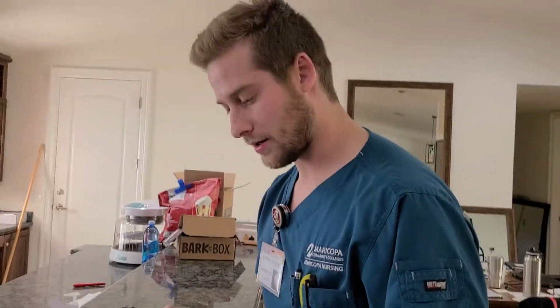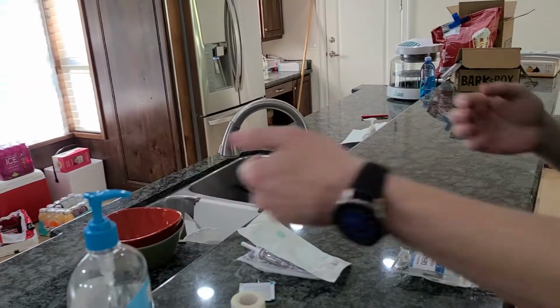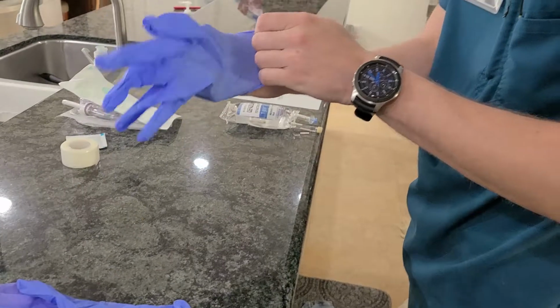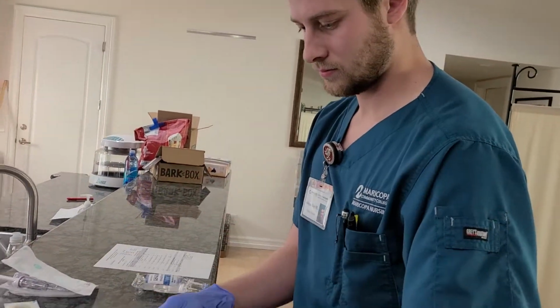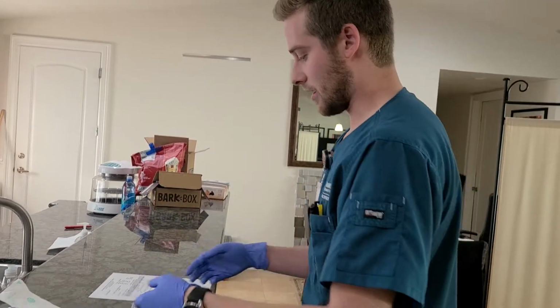Now that I've done my math, I am ready to prep the med. I'm going to wash my hands and put my gloves on. Now I have my medication.